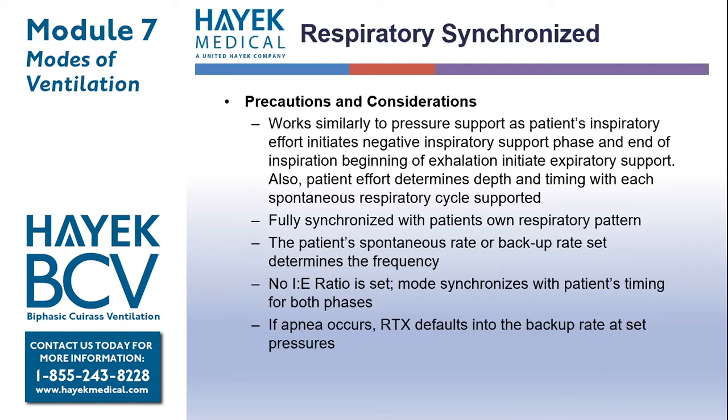Respiratory synchronized works similarly to the positive pressure mode of pressure support in CPAP. The patient's inspiratory effort initiates the negative inspiratory support phase, and the end of inspiration begins the exhalation phase. So the patient's breath timing is driving the cycle timing of the device, fully synchronized with the patient's own respiratory pattern. The patient's spontaneous rate or backup rate set determines the total frequency.